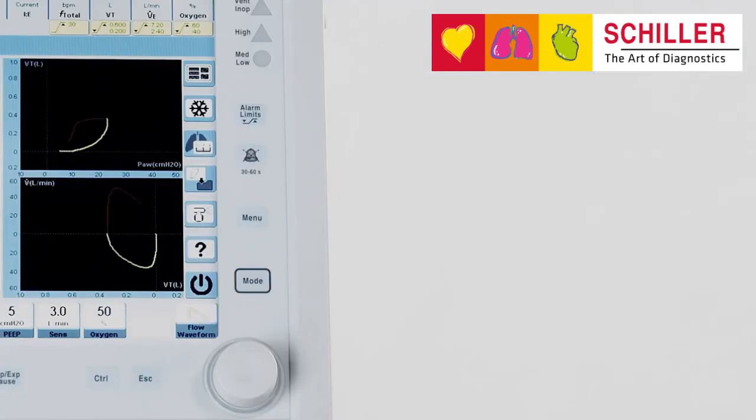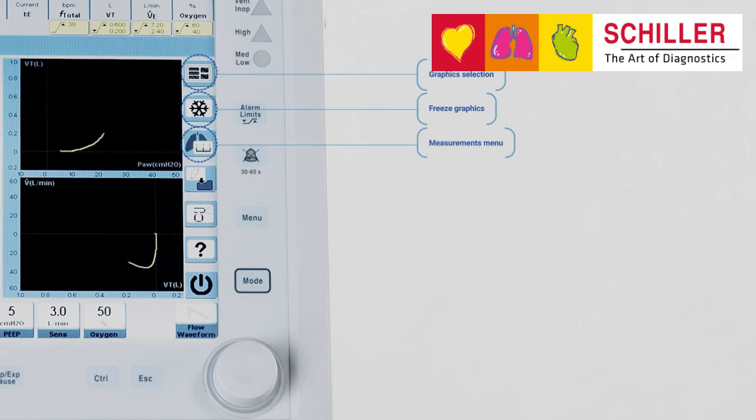Touchscreen keys have the following functions: select graphics, freeze graphics, access measurements menu to calculate the patient's respiratory mechanics, save reference loop.